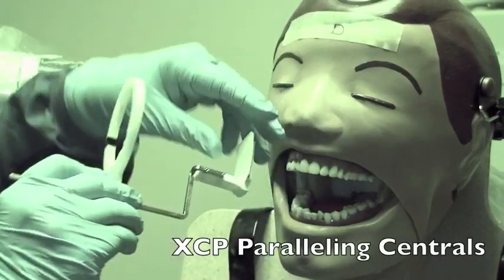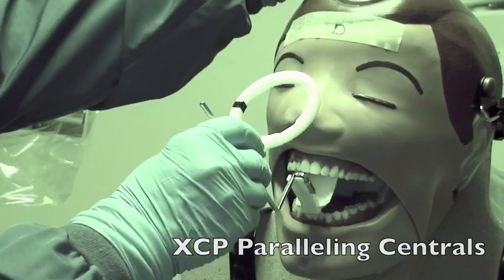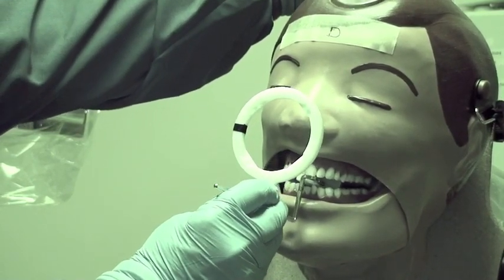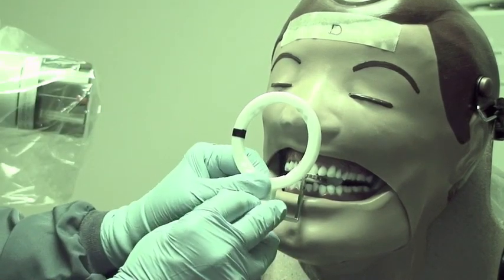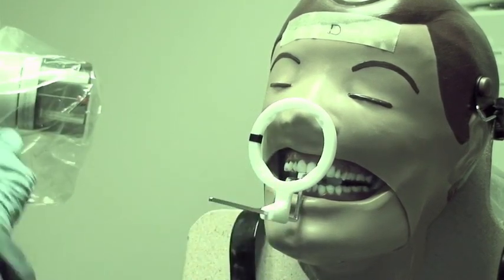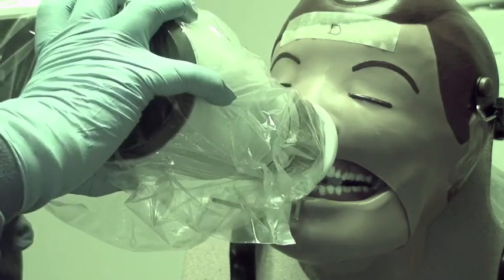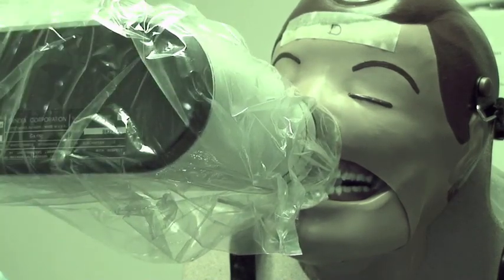For the central incisor view, put the dot in the slot the same way. Lay it back in the palate and have them bite between where the prongs go into the holder. Bring your ring in and center the centrals on your film. Then line this up so you're parallel to the ring.